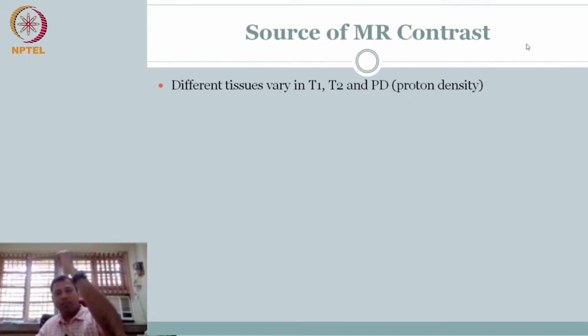So that means alpha is a parameter that you control, including how long you want to apply it. Alpha is one parameter that you can control, and depending on it, the signal you are measuring might be different. So alpha is under your control. Last class we talked about one other thing: after you push it, you can allow it to dephase and then I can do an echo.